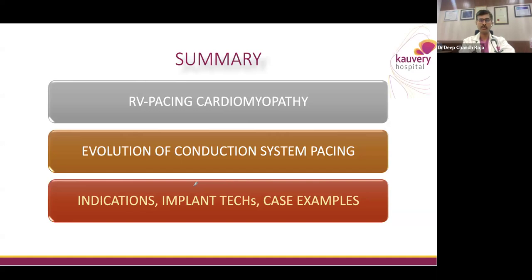But then indication number 2 is a heart failure indication for cardiac resynchronization therapy, where you are looking to correct the left bundle branch block. There are no excuses here. You try your best to narrow the QRS and capture the left bundle. You start looking at left bundle branch potentials. You start looking at all the criteria. You make sure, even if you fail one or two times during the case, that on attempt number 3 and attempt number 4, you get the left bundle branch capture.